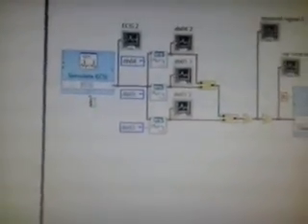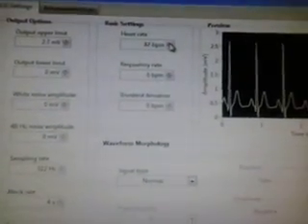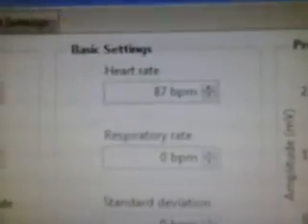Here, this is your heart rate value 72. The value indicated here is also 72. Now let us check if it works for another value. We'll change the server value, that is the simulated ECG signal value, to around 87. The heart rate here we defined it as 87. Now we'll run the signal server, run the client.